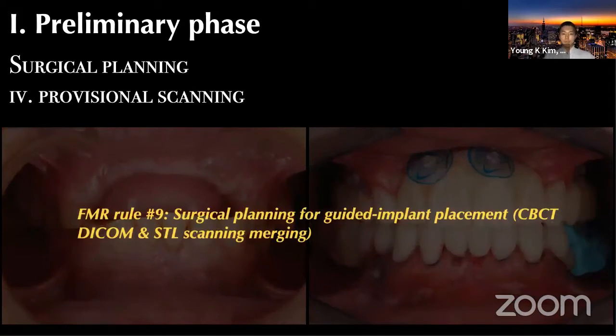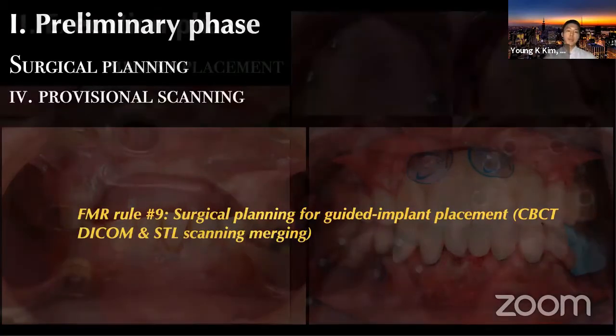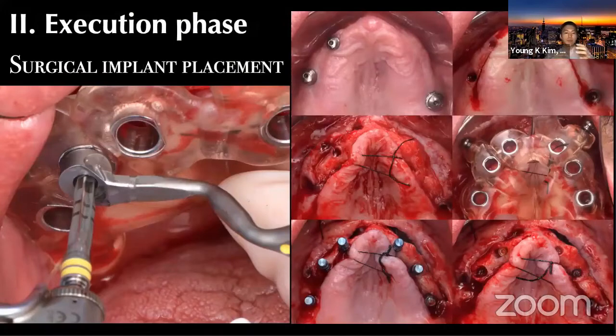And then we have number 9, the surgical planning for guided implant placement, with the CBCT DICOM file and STL surface files, and doing the surgical implant placement. Again, you need to see the range of motion in order to really evaluate the spatial flexibility that you have. And really, it depends on the phases and sequences of each patient case. If you're doing guided bone regeneration or sinus lift, bone augmentation, or tissue augmentation, it really depends on your specific treatment plan, phases, and sequences.